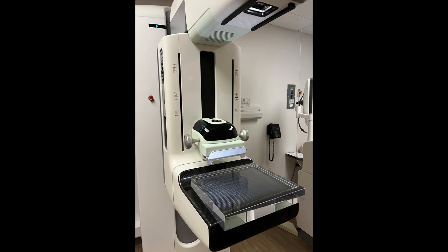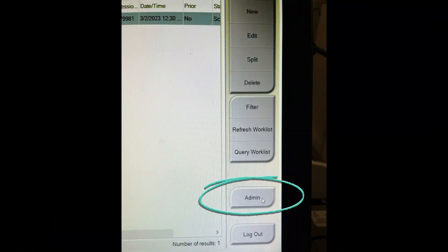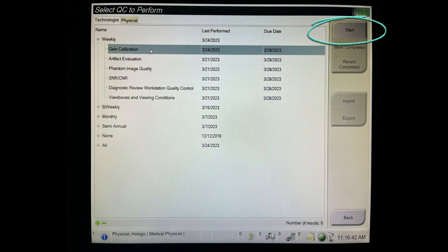Next, you'll want to place the flatfield phantom on the digital detector. You'll then go back over to the acquisition workstation and click on Admin, Quality Control, and then the Technologists tab. Select the gain calibration and then start.